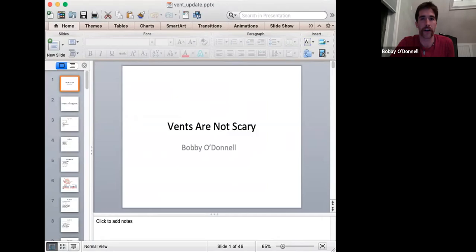That's kind of all I have for everyone for tonight. I know that was kind of a lot, and there's a lot that we went over. I was talking about maybe making a cheat sheet that we could put through the vents, but I think the best thing is really the next time you get on a truck to play around with the test lung and work off of these settings and things that we went over so we can become proficient in it and try to provide some good patient care.